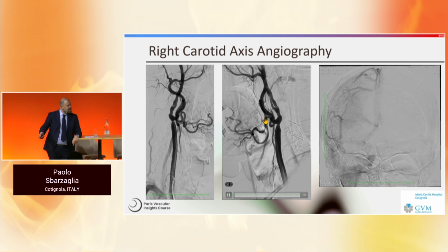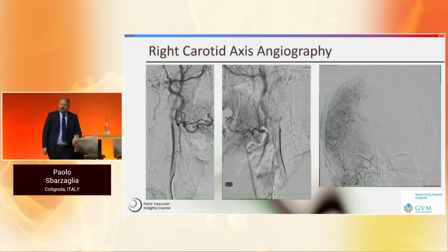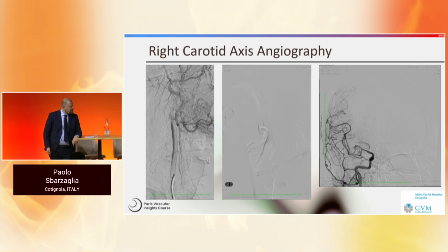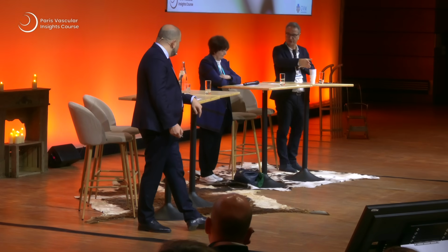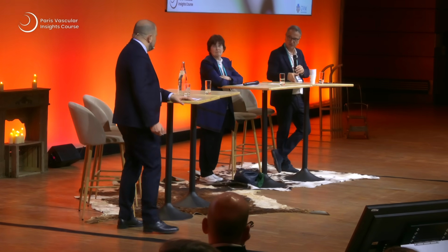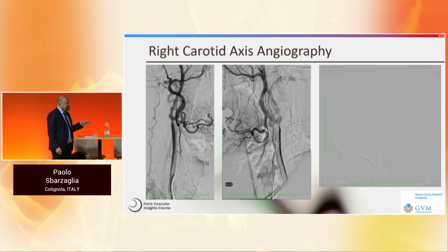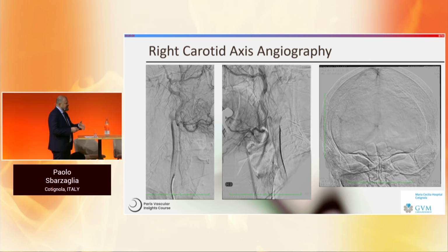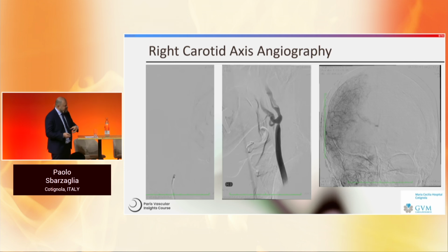Paolo, may I interrupt you? I may have missed it. You had a duplex scan and then you had the CTA before you did the angiogram, or did you go directly for your angiogram? CT and duplex ultrasound. And to echo what Isabel mentioned, do you have also investigations before this, 3 years after the procedure? Do you have duplex or CT scan before, or when does this restenosis happen? This is the final part of a long path with many CT scans and duplex ultrasounds, which were not very clear about the good results from the very beginning.